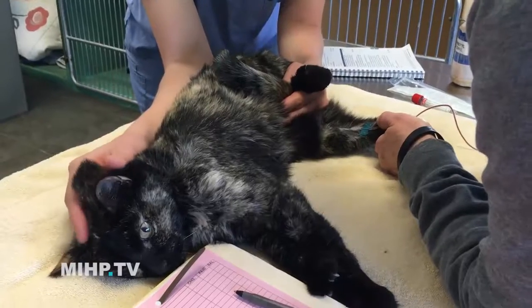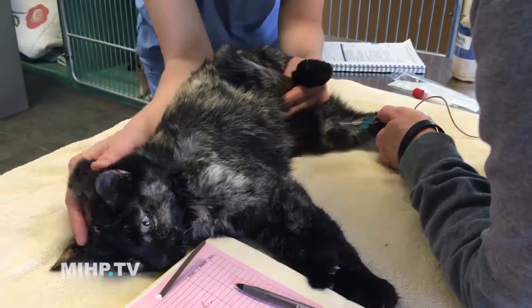If, however, they're a little bit nervous, or if they move around a lot, we don't want to draw it from the neck. We can also draw it from a back leg. In dogs, we'll draw it from the outside of the back leg, that is the lateral saphenous. And in cats, we'll draw it from the inside of the back leg, which is the medial saphenous for you nerd people out there.